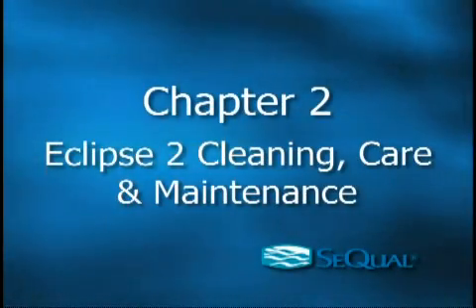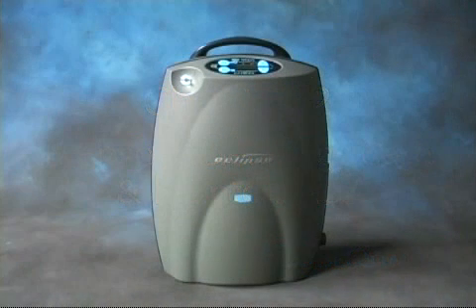Chapter 2: Eclipse II Cleaning, Care and Maintenance. The Eclipse II is designed to provide years of carefree service with minimal user maintenance. Here's an overview of the routine user maintenance we recommend.